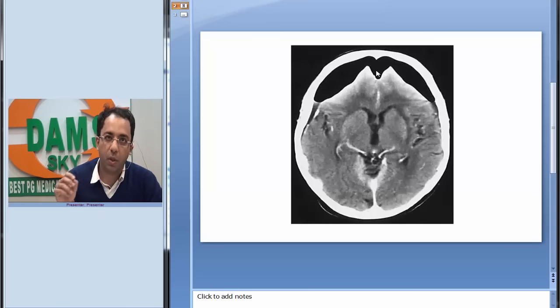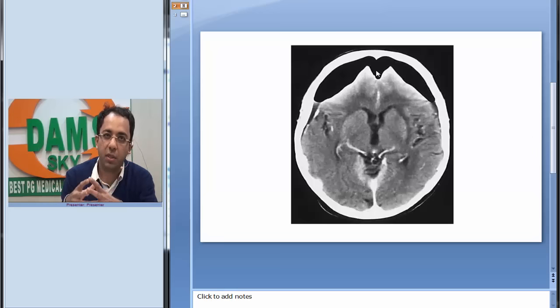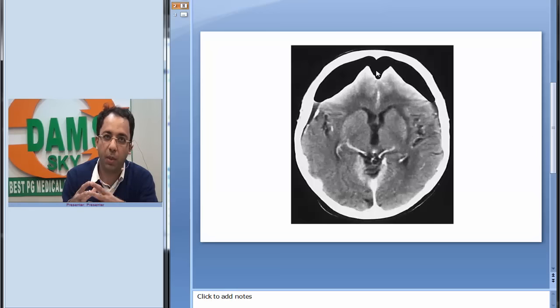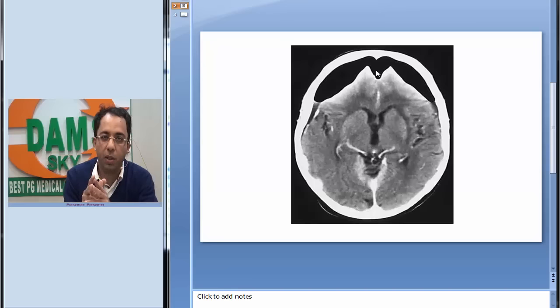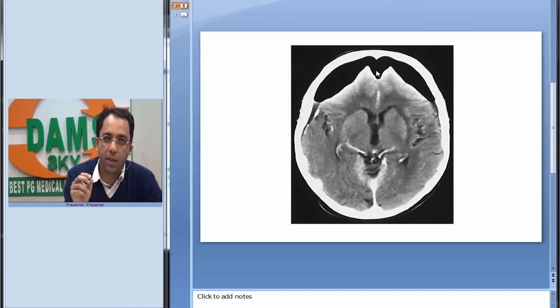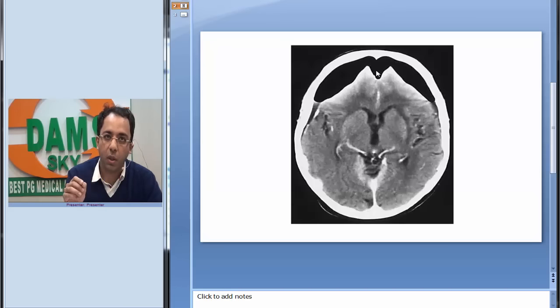This pneumocephalus is causing separation of the two peaks. This appearance has been called the Mount Fuji sign because of its resemblance to the mountain Fuji in Japan, where you have two peaks on the top of the mountain. This indicates that this pneumocephalus is tension pneumocephalus.